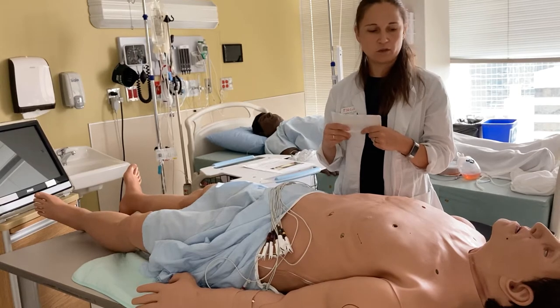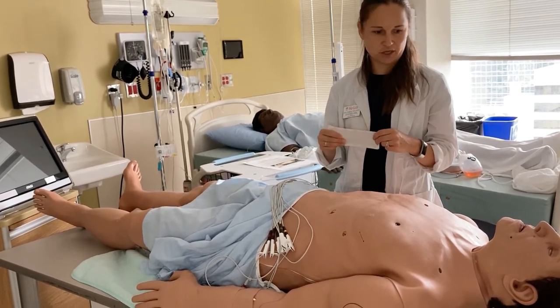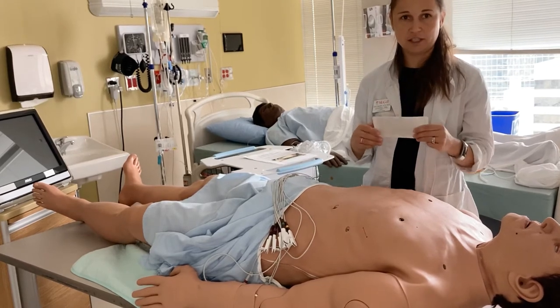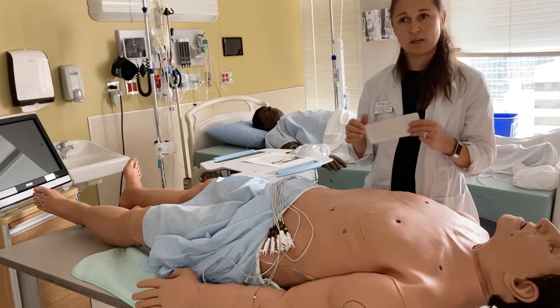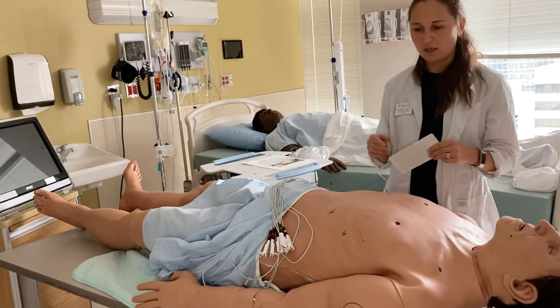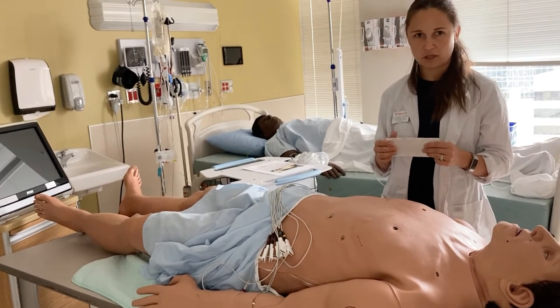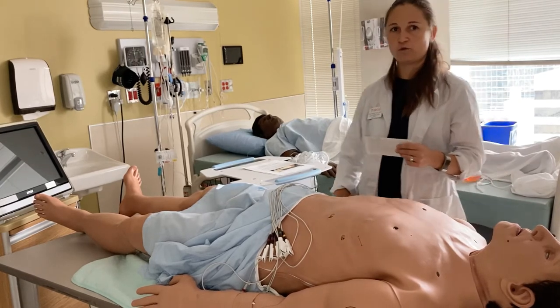The location of these stickers is very important because it will allow you to get a precise EKG for your patient — for you to be able to read it correctly and for the doctor to diagnose it. When we are placing our lead electrodes, we try to avoid bone and want to place them on muscle. You will see that the placement of EKG electrodes is a little bit different from the electrodes you use for cardiac monitoring, because EKG electrodes will actually go further away from the patient's body on the limbs.